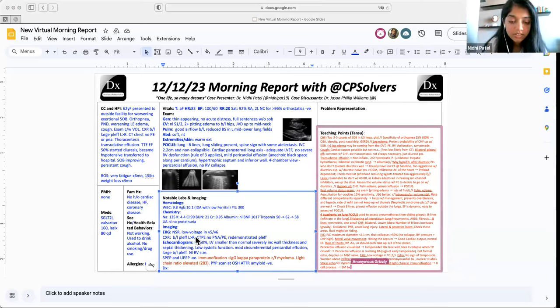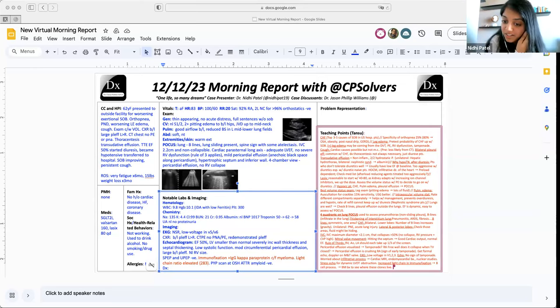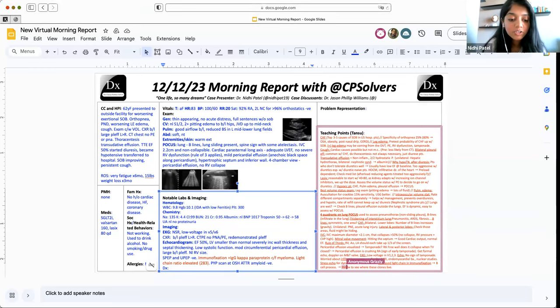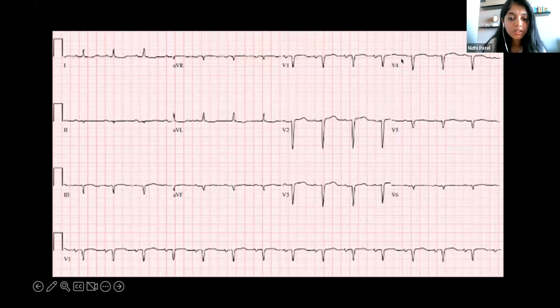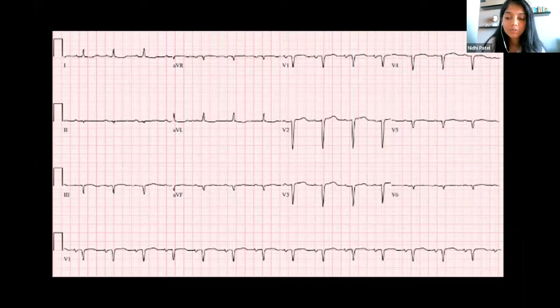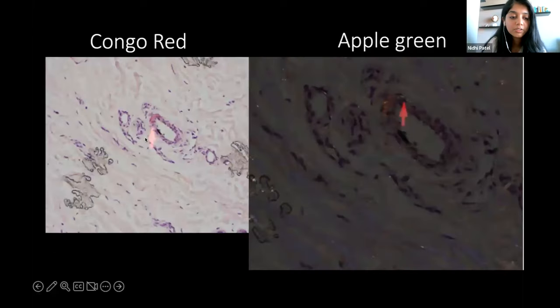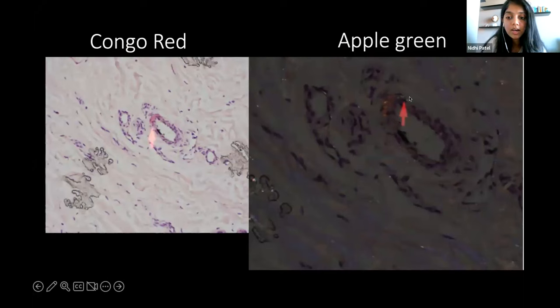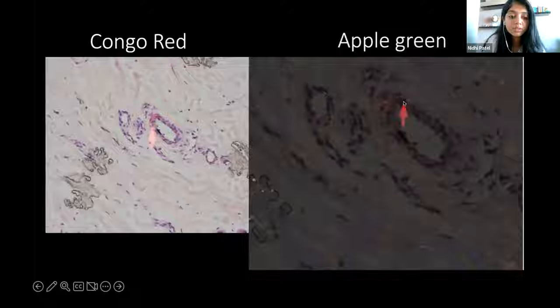Awesome. I like fat pad biopsy too. I think that's a fun suggestion. I've never seen it, but that is one of the test options. Yeah. So the next step was actually to get a fat pad biopsy to look for light chain AL amyloidosis. And I actually have the images from the biopsy. So you guys can see it was my first time seeing them as well. But the classic buzzwords that we hear on step exam, the Congo red and the apple green birefringence. So in this one, this was a fat pad biopsy that they had done. And you can see this was under the Congo red stain. And then this was the apple green birefringence that you could see on the biopsy, which confirmed the diagnosis, which was AL amyloidosis. And then we also did get a bone marrow biopsy, which was suggestive of multiple myeloma.